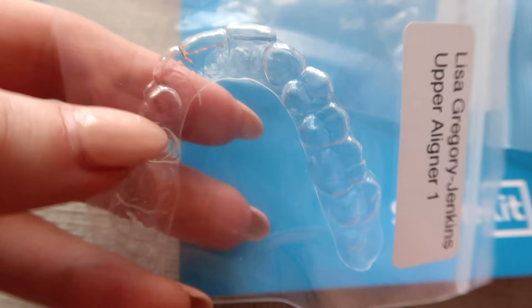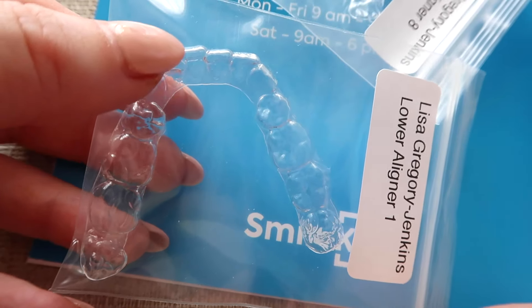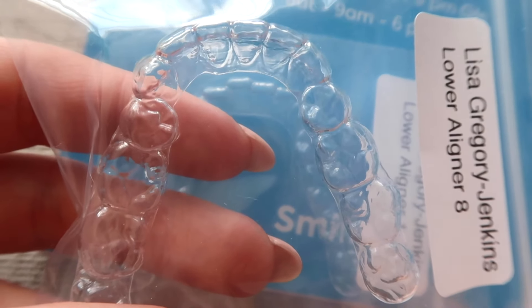What's great about getting a package like this is that you can see your first aligners and your final aligners and see just how straight your teeth are going to look. Somebody mentioned on my last video that they probably wouldn't trust this kind of treatment, but they are actually from dentists - it's all approved. The dentists are medical experts and know exactly what they're doing. And if you get to this point and decide you don't want to pursue it, nobody is going to force you.